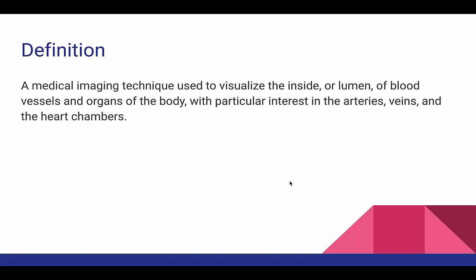This can be problems related to the coronary arteries of a person, which is never nice, and therefore this technique carries a high importance in the vascular pathologies, their detection, the interventions that are done to prevent harm to the patients.